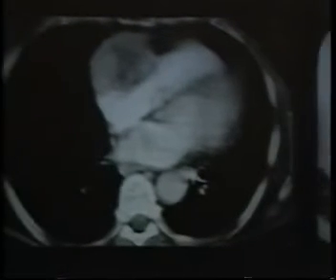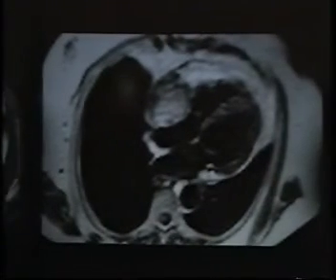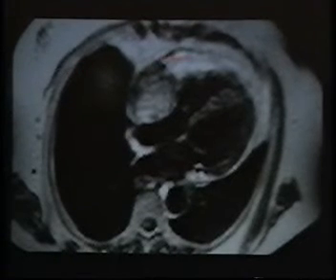the chest film to the right of the heart, or at least fusing with the right atrial contour. Echo showed a lesion. Again, this is a four-chambered view where this is the right ventricle, right atrium, and there is a lesion in the wall here. They couldn't tell any more than that, just that there was an abnormality. MR examination, well, this is CT, and a dynamic CT with contrast in the heart did show a mass adjacent to the right atrium, but MR shows very nicely this large mass inside the pericardium.